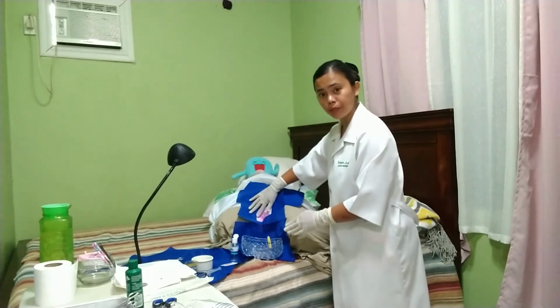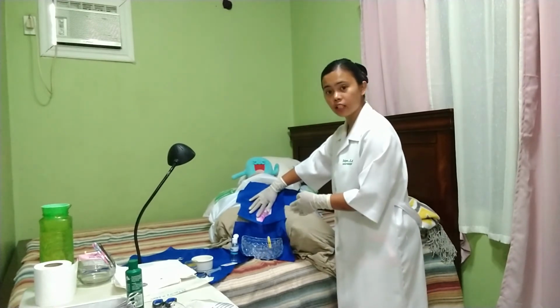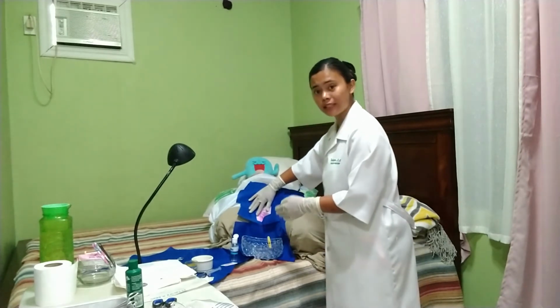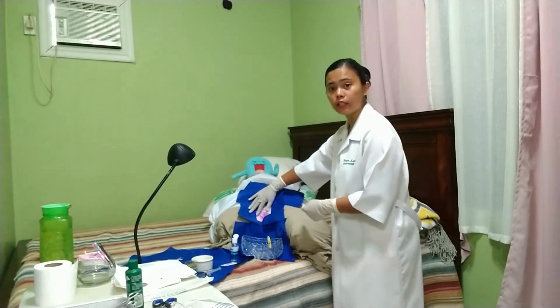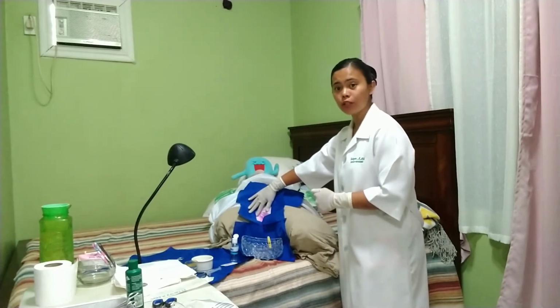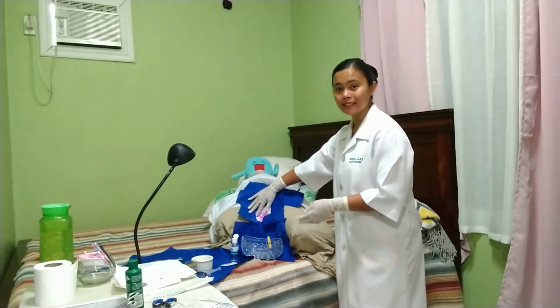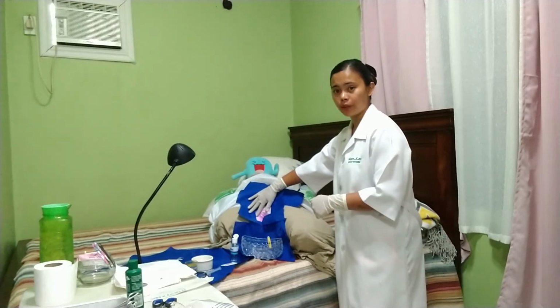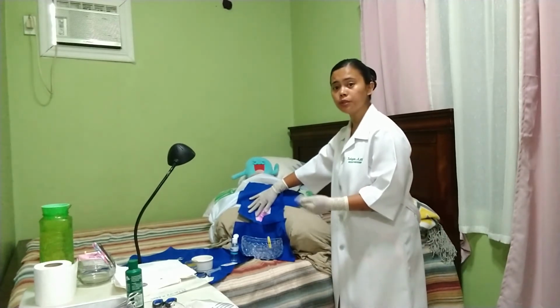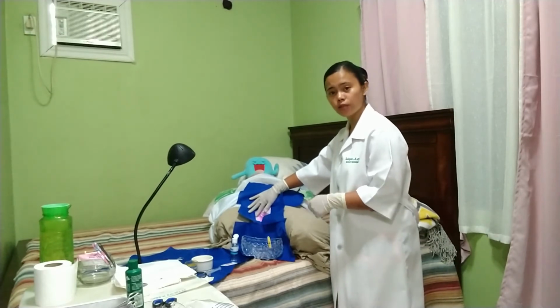After moving the collection container and the kidney basin near the perineum of our patient, we may now insert the catheter gently and slowly. We have to ask the patient to bear down as if trying to void because that will relax the external sphincter of our client. Also, remember to let the patient take slow, deep breaths until the initial discomfort would pass.